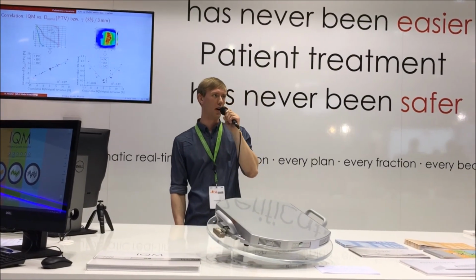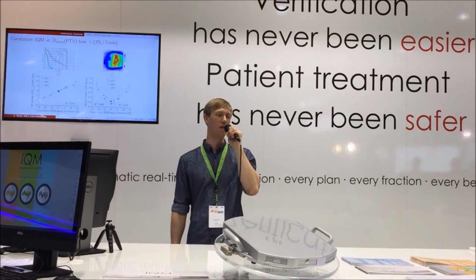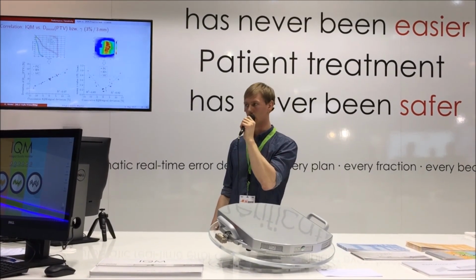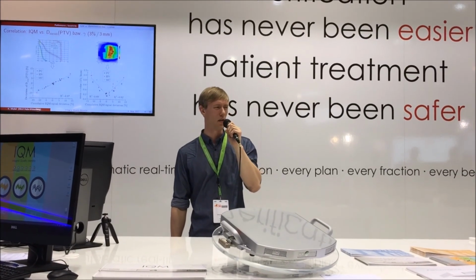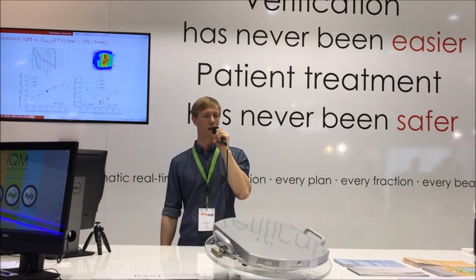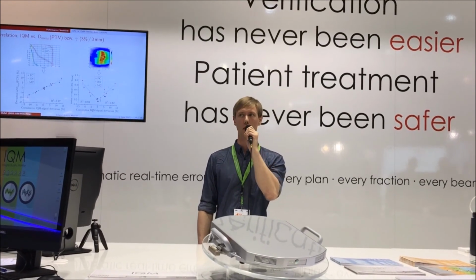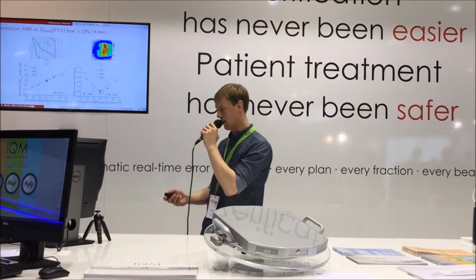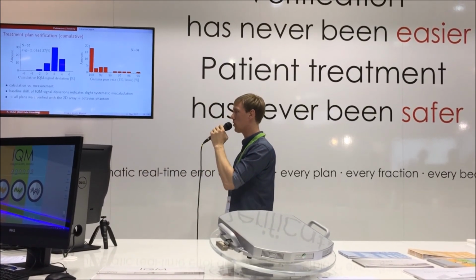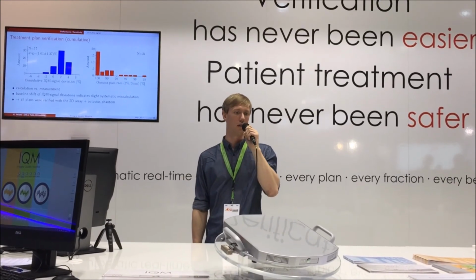Until this point, I've only been talking about the comparison between two measurements, so let's now focus on the pre-treatment or the treatment plan verification capabilities of the IQM, comparing the predicted calculated signal to the referring measurements. Over the period of about 6 months, we've been using the IQM as a pre-treatment QA tool along with our 2D array within the Octavius Phantom. And within this period, we collected lots of data that we shared with IRT and then optimized the parameters for our dose engine. And this graph here, with the blue bars, shows us the frequency distribution of the cumulative IQM signal deviations within the margin of -6 and 6% of the latest version of the dose engine.